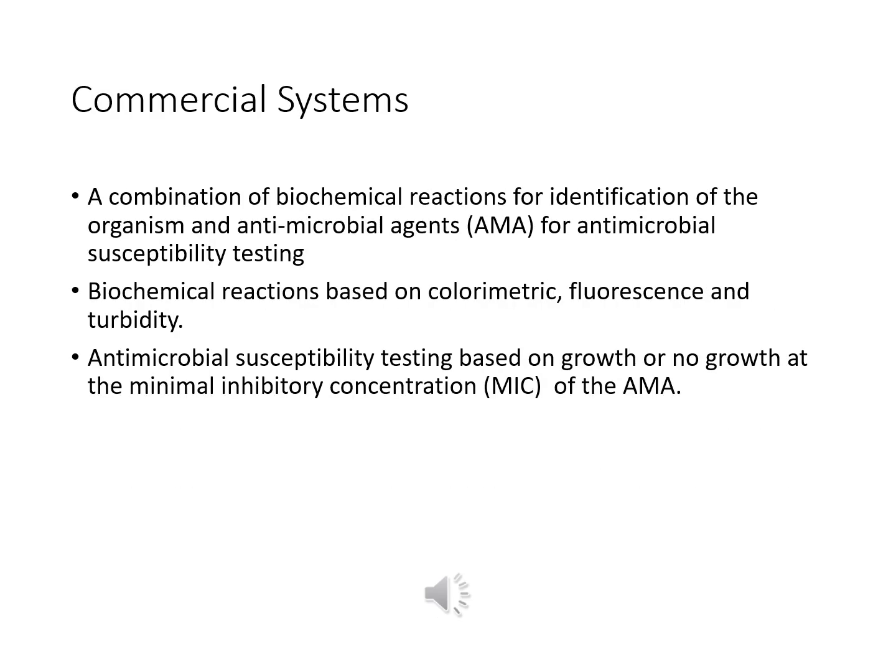And then we do have a plethora of commercial systems. Whether this is something like a Vitek or a MicroScan WalkAway, you will have inoculated the well. It is part of that panel that will include biochemical reactions as well as antimicrobial drugs at different concentrations. So you're going to use the biochemical reactions for identification of the organism, and then you're going to use the antimicrobials to determine the sensitivity or resistance of that specific organism for each of the drugs.